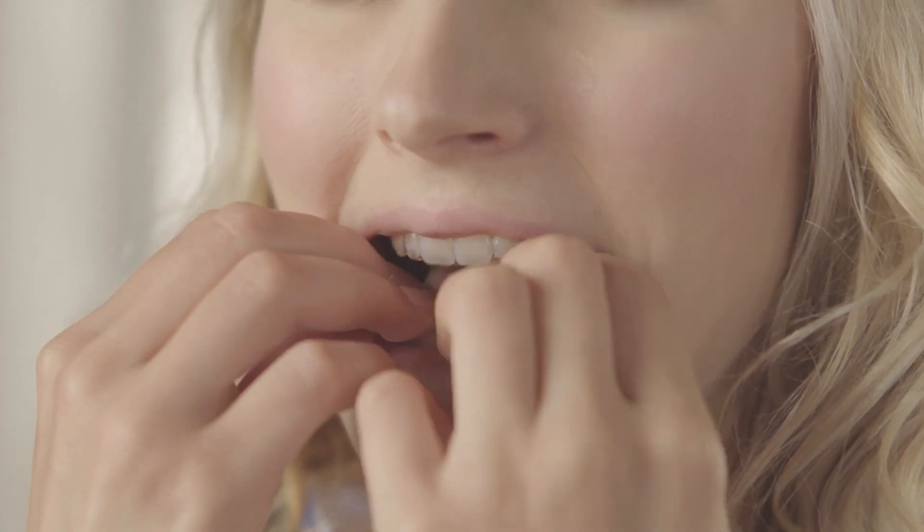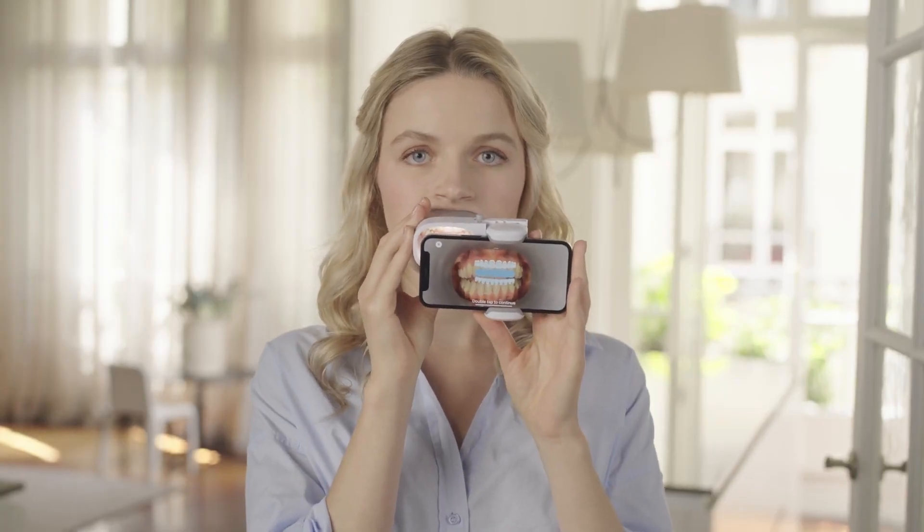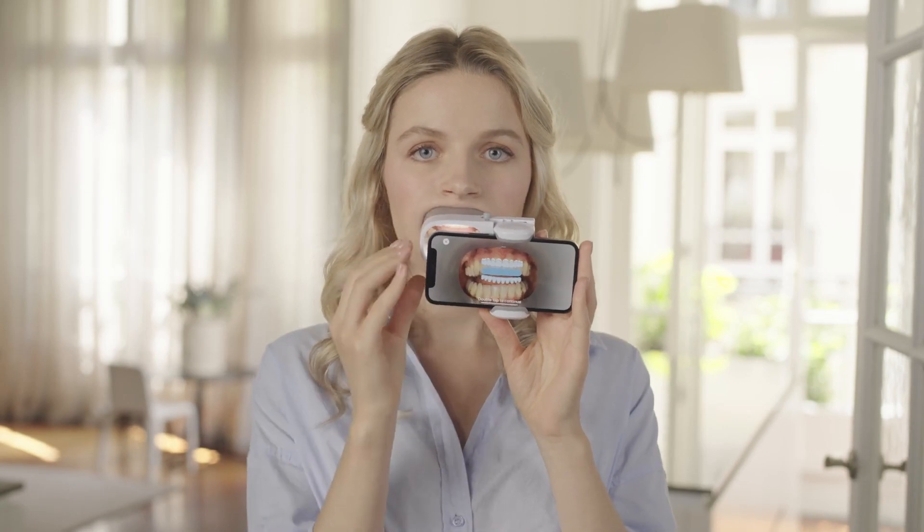Insert your aligners. For this next step, you'll have to keep your teeth slightly apart and scan side to side. Double tap to continue.